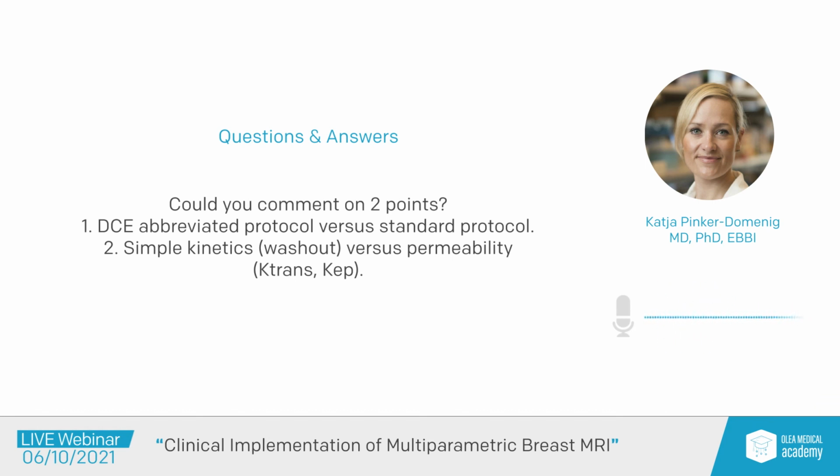When we say abbreviated MRI for screening, the idea is we want to know: is the scan normal or abnormal? Do we need to do something else? If you have a difficult staging situation where you want to know, is that a satellite, do I have to do other biopsies, what is the extent of disease, then I think abbreviated MRI is not the way to go. I think we will have toolboxes. Abbreviated MRI will be in the screening toolbox, and a full protocol will be in the other toolboxes, for instance pre-surgical staging and assessment of residual disease post-chemotherapy.